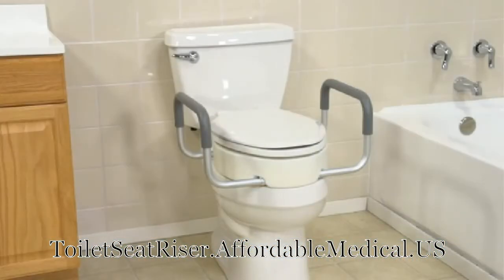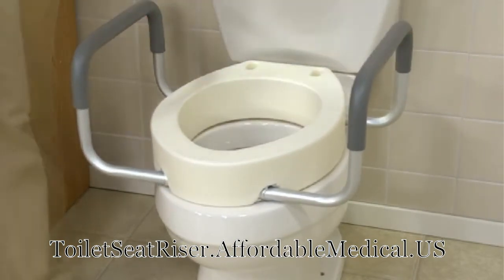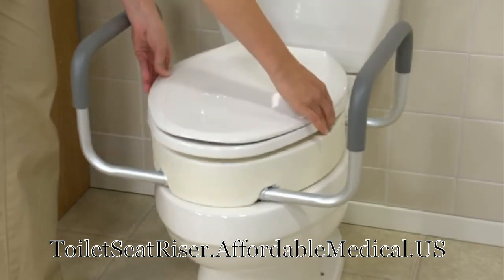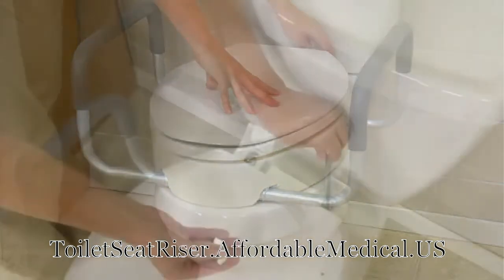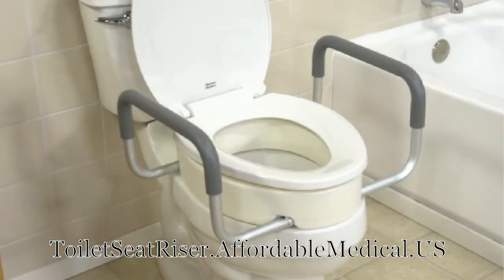This elevated seat attaches easily to the toilet without the use of tools and comes in both standard and elongated seat sizes. The seat riser is used with your existing toilet seat and lid — simply remove, secure the seat riser to the toilet bowl, and then attach your seat and lid. Now you have three and a half inches of elevation.